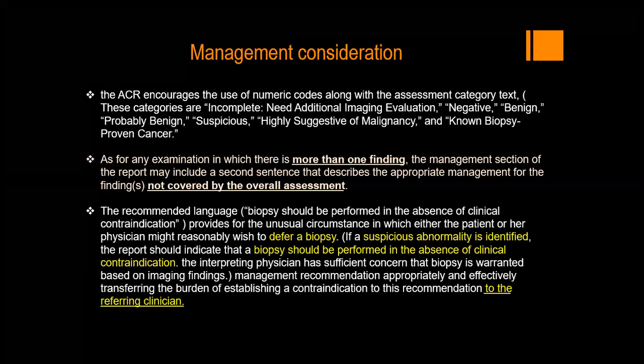And we described already the sentence: if a suspicious abnormality is identified, the report should indicate that biopsy should be performed in the absence of clinical contraindications. These recommendations provide for the unusual circumstances in which either the patient or her physician might reasonably wish to defer the biopsy.